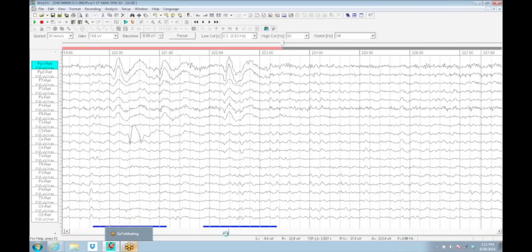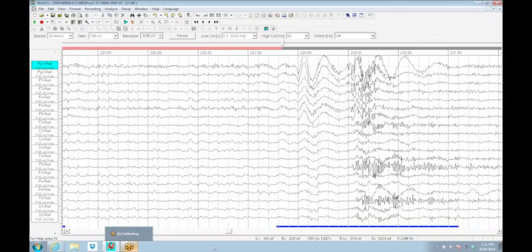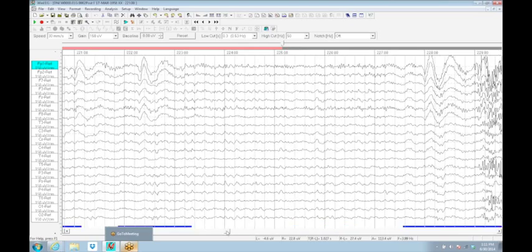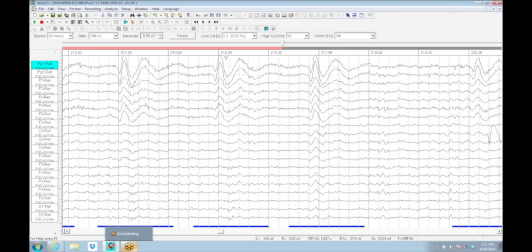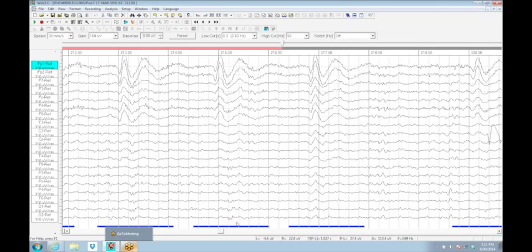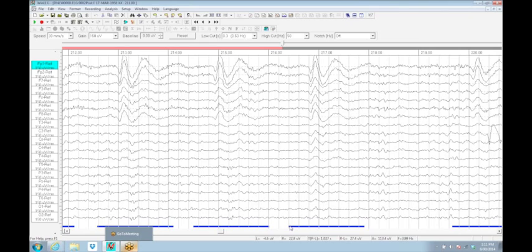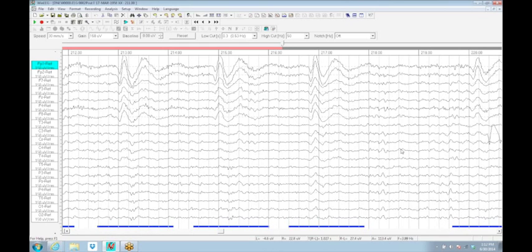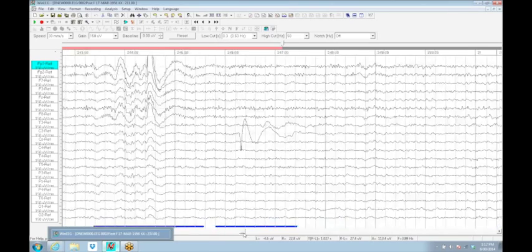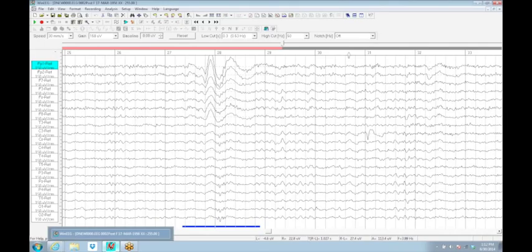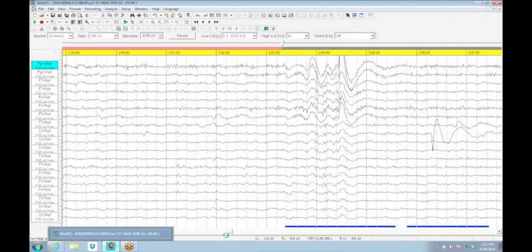There's another approach available within this free software. That's to identify all of these eye movement-related components and to zero out that component so these are extracted, leaving this piece of EEG which, other than the eye movement, has perfectly normal healthy stuff you'd want to analyze. Every time you cut the EEG to splice small pieces together, you end up causing small discontinuities which impact the spectrum. You disturb the state of the EEG.